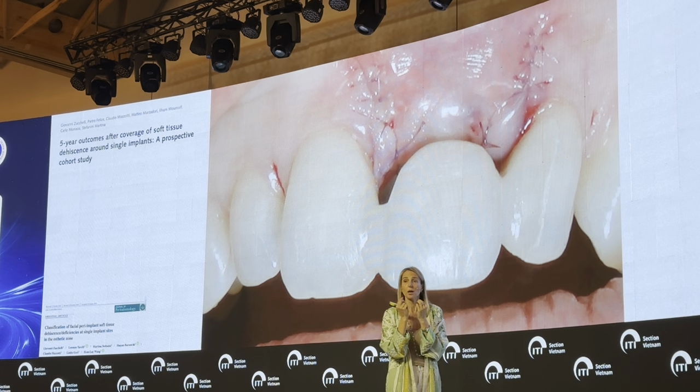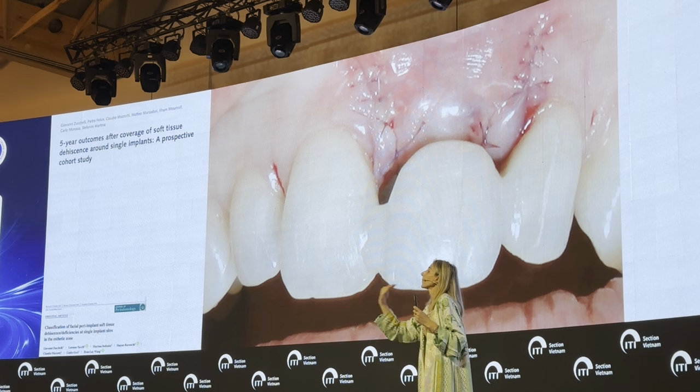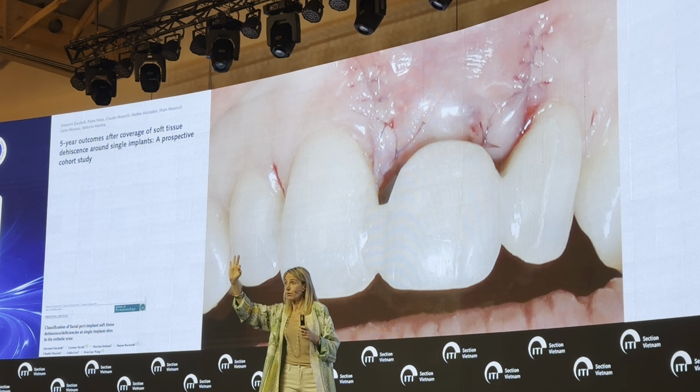because in the majority of the cases, when I start my surgical procedure and I pull the lip of the patient, the muscles of the lip are perpendicularly inserted at the level of the gingival margin. What does it mean? That the vestibule depth is 0.